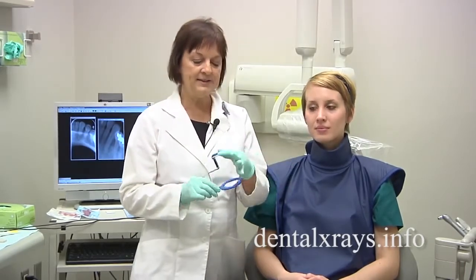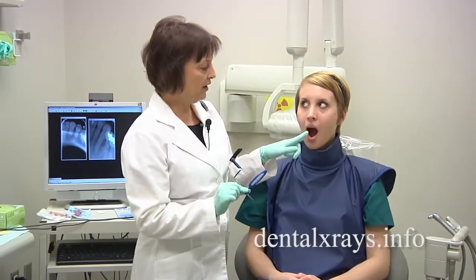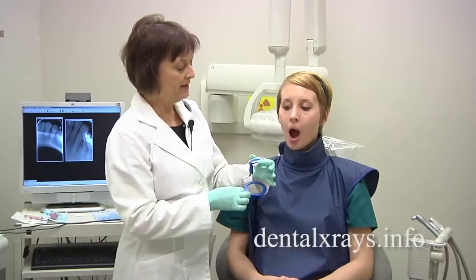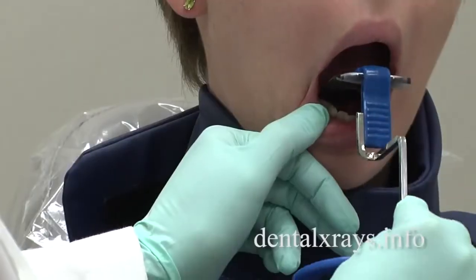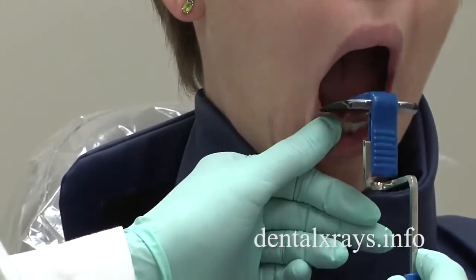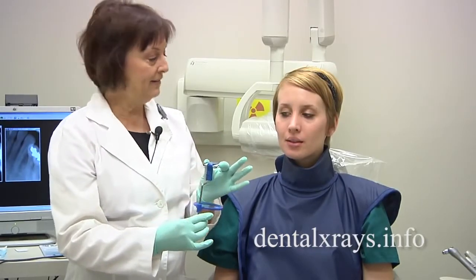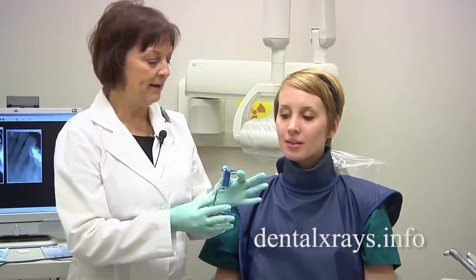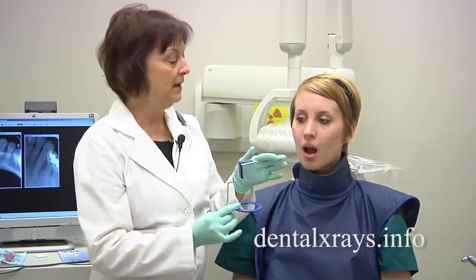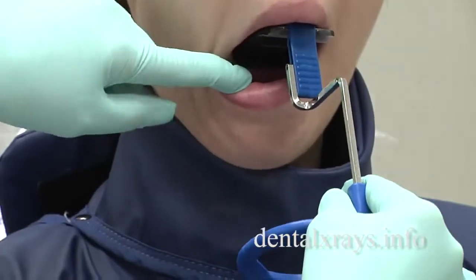The size film is a size 2, and many times it's too large for a very, very narrow mouth like this. It doesn't fit — you cannot get it from side to side behind those front teeth because it is way too wide. So there are two options: switch to a narrow size 1 film, or if your office doesn't have them, place the very edge of this film farther back into the mouth so that it actually fits between the dental arch.